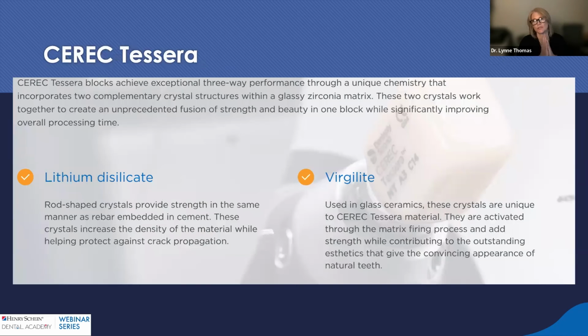All right, I'm going to switch gears now and talk about lithium disilicate. This is the newest lithium disilicate and it is called CEREC Tessera. This is a great material. It is very aesthetic, very strong, and I really like it.